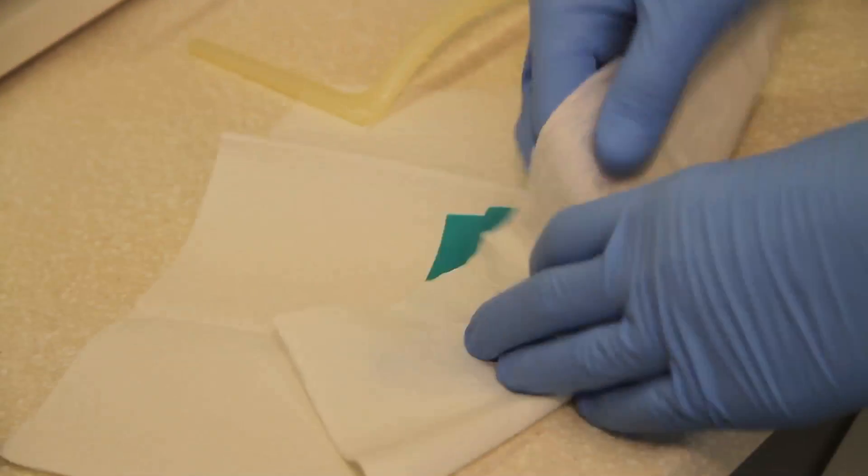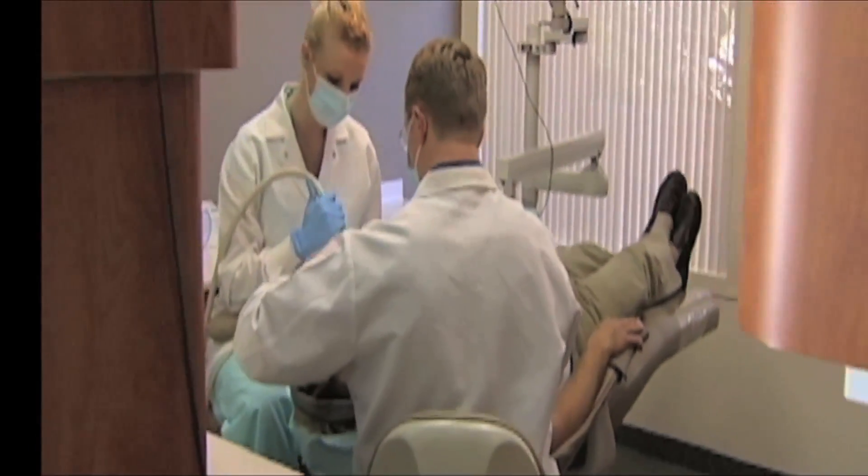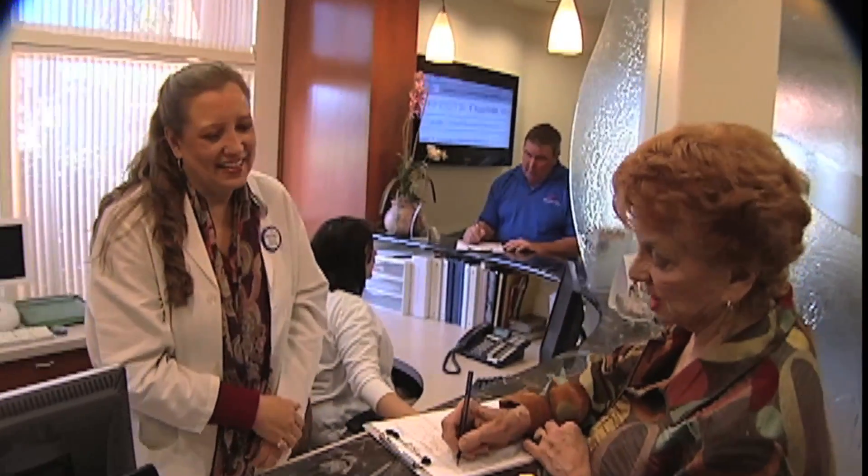So when we're done, we take off the clamp and remove the contaminated mercury shield. It is carefully folded and wrapped in our gloves for disposal. We know that with the protocol at Leighton Dental, you're going to be safe. The doctor and assistant are safe, and the whole office is safe from mercury contamination.